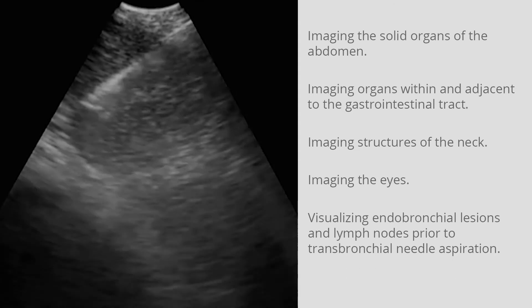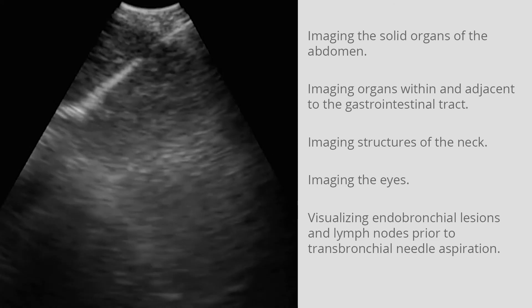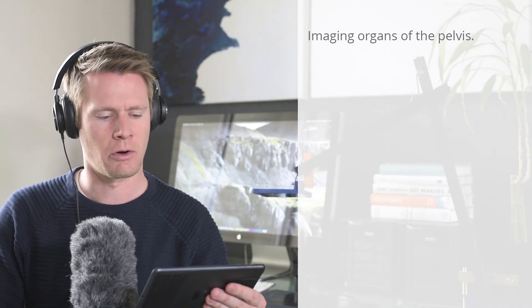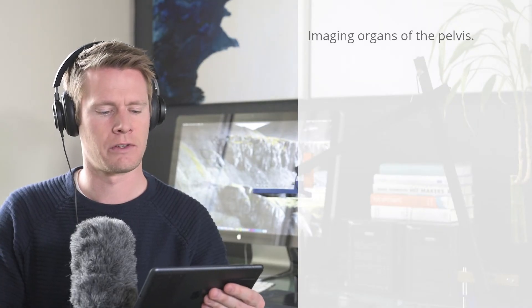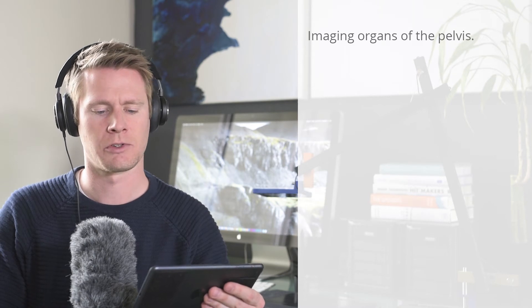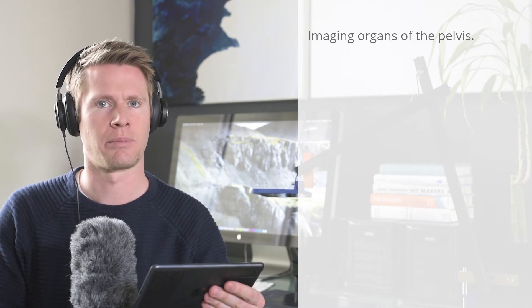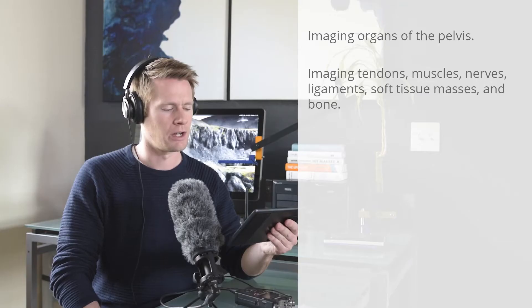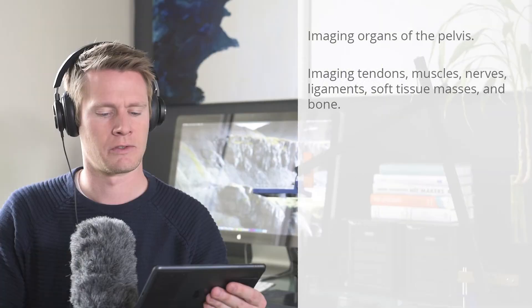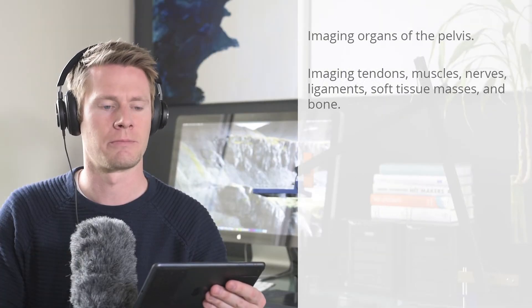This practice is known as endobronchial ultrasound, or EBUS. For imaging organs of the pelvis, such as the bladder, uterus, ovaries, testicles, and prostate. For imaging tendons, muscles, nerves, ligaments, soft tissue masses, and bone.